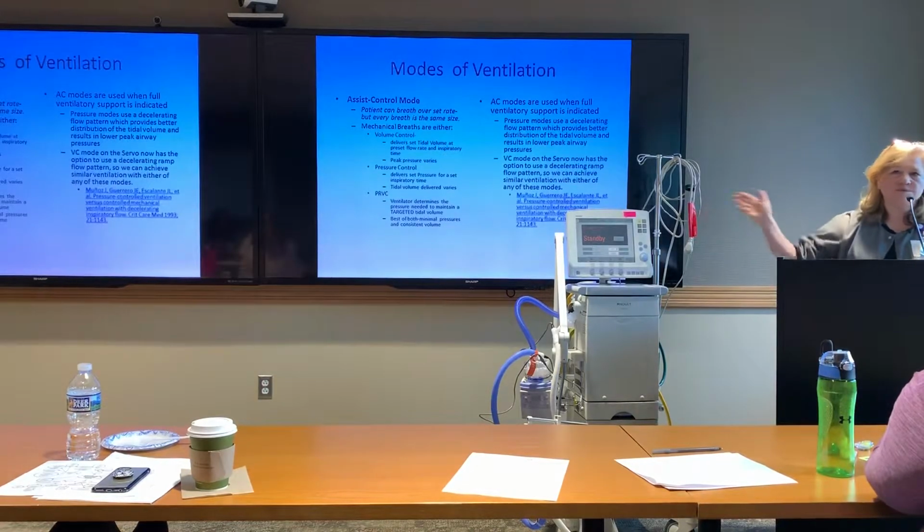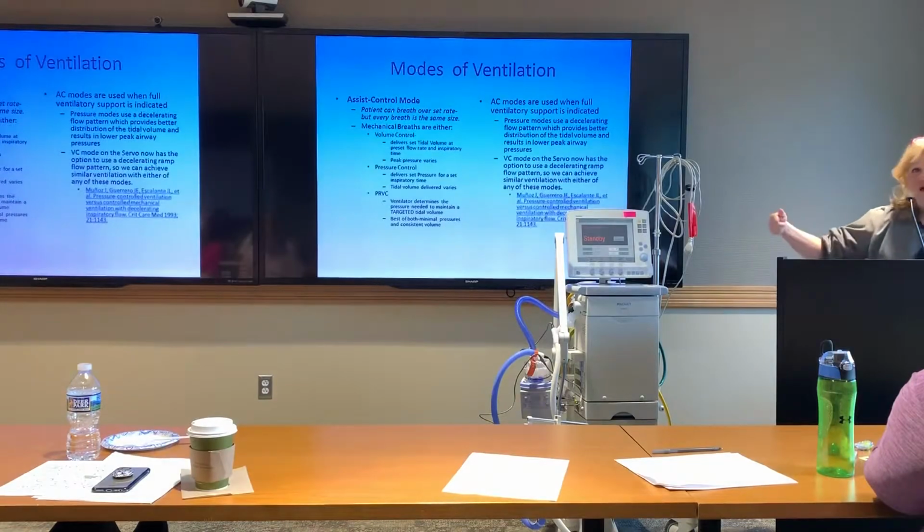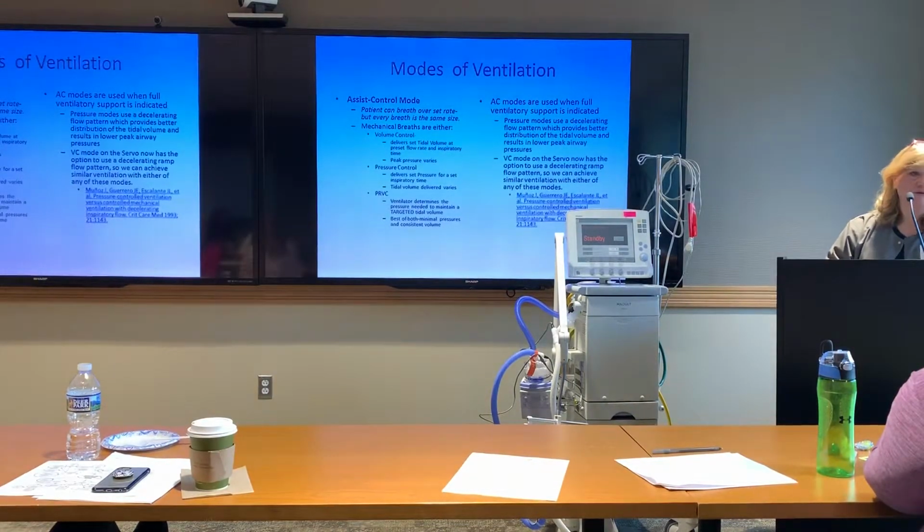I can make the breaths basically look the same if I go from volume control to pressure control because I tweak all my other knobs. So it really doesn't matter. There is none that is superior. There are maybe reasons I might want to use one over another, but generally speaking, overall outcomes, it just doesn't matter. You can ventilate them effectively as long as you know what you're doing with that mode that you've chosen to work with.